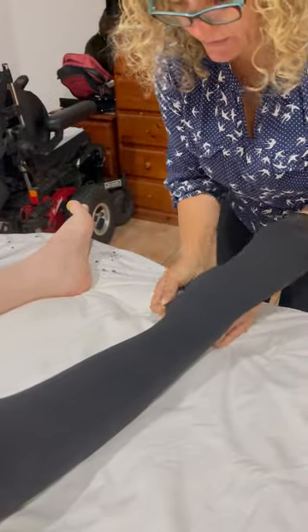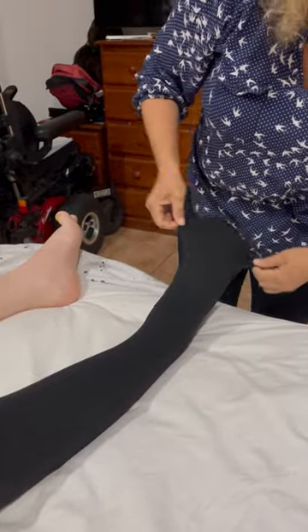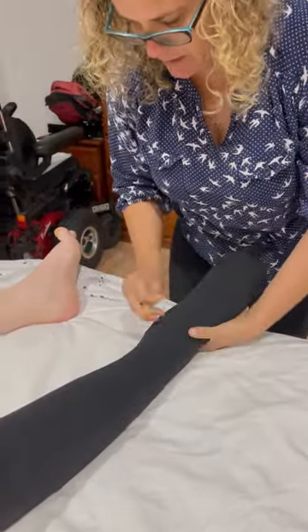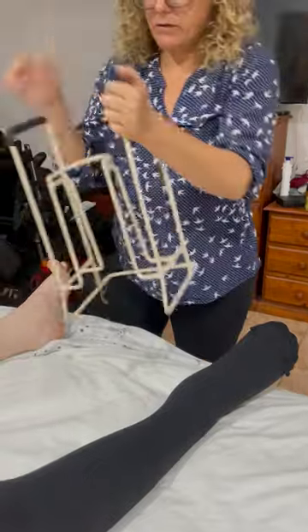Then the rest of the sock comes up. Once it's on, you can readjust it by pulling the heel back down over the heel, give the toes a bit of breathing room, and just make sure there's no wrinkles that are going to pinch during the day.